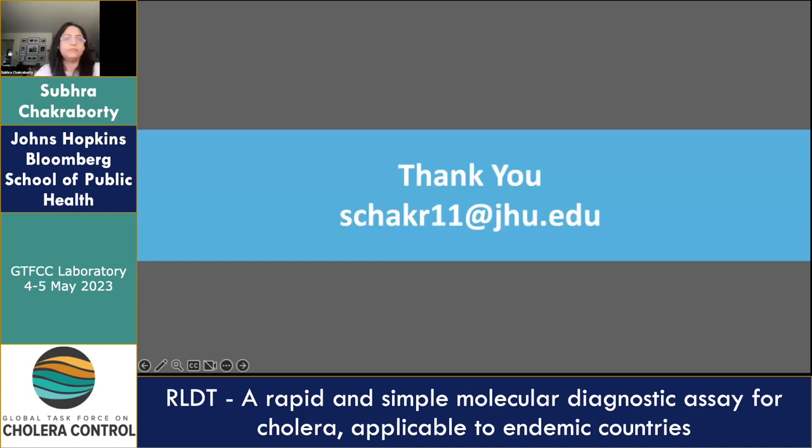Thank you. Nice presentation. I wanted to know what is the cost per test using your assay, and how much is the reader? I know the heater doesn't cost that much, but the reader may. Yeah, the test doesn't cost that much. It depends on how many you are procuring, because it goes in tiers. So it is pretty comparable with other assays. The reader costs a little bit more. It's around 7,000 currently, but it is commercially available, and they're making a next batch, a new model from next year, which will be at a lower price. But on the other hand, I want to mention that this machine can be used for other targets also, other pathogens.